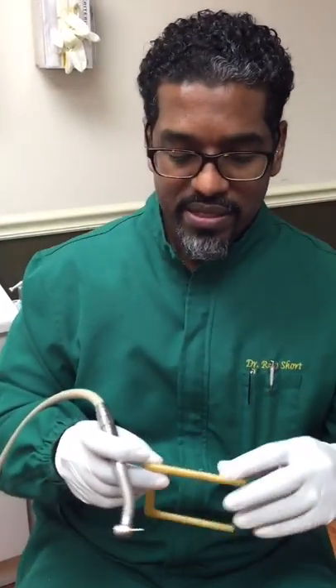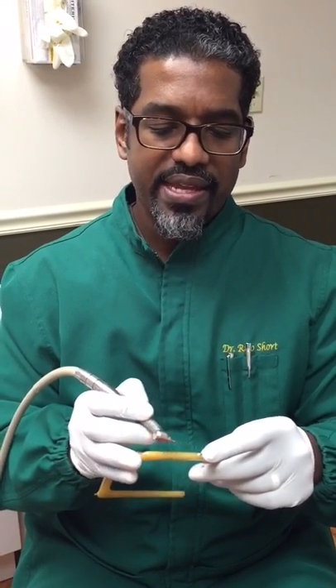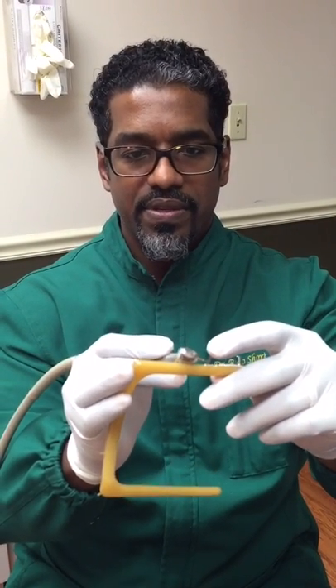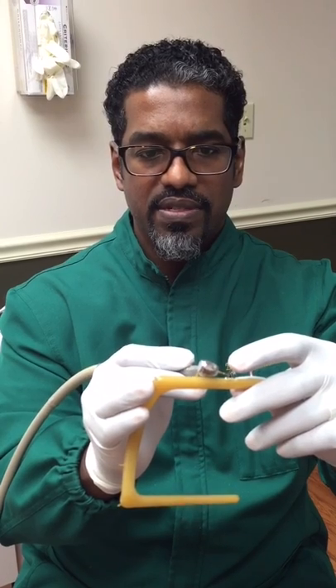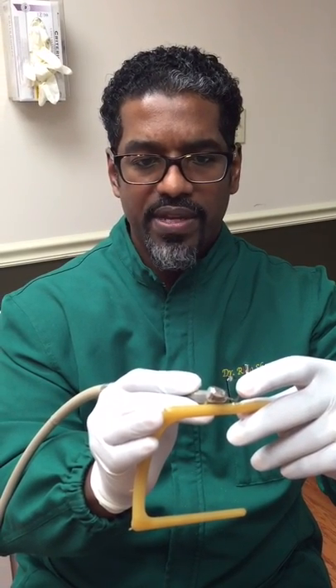Then you use your 1958 burr and you're basically going to section it, leaving about 3 or 4 millimeters hanging out — about the same amount you have on the plastic prong. Make sure you have safety glasses while doing this, because sometimes these things can just fly off, and the top of it does heat up, so you want to be careful.